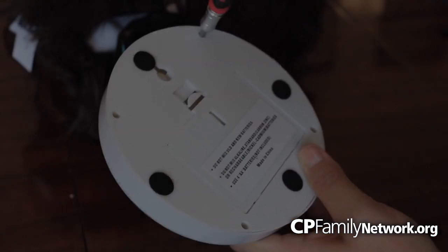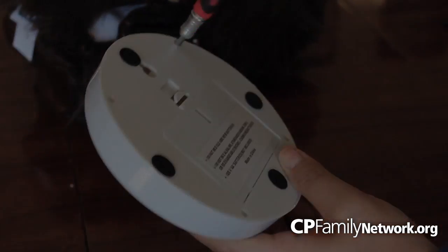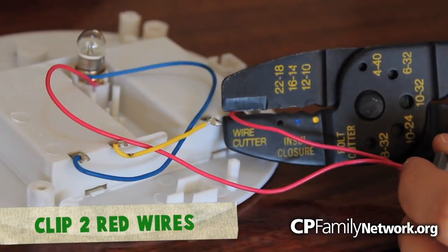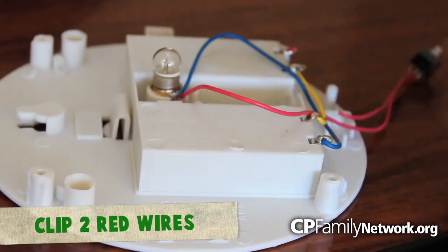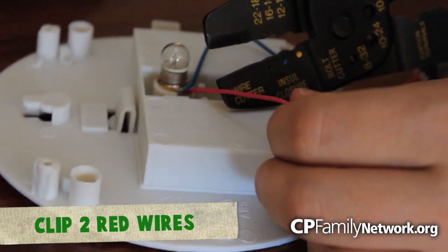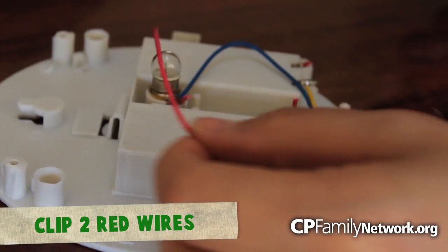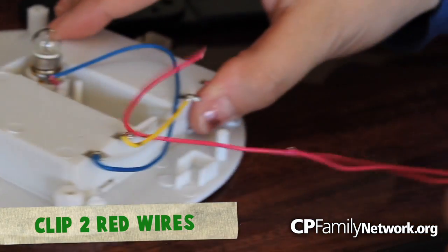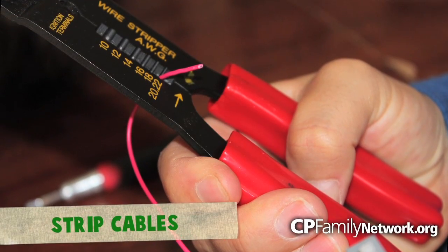Get your push light and open up the back of it. Here you'll find two red wires. Cut both of these wires. Make sure you don't have any batteries in the light. You will need to expose the copper wires on these as well.